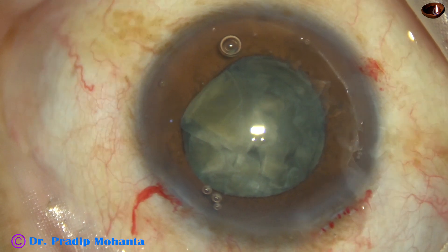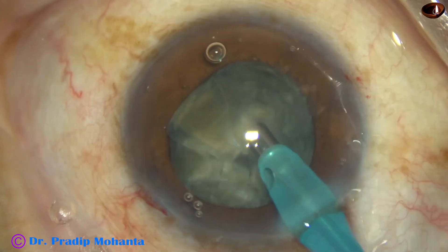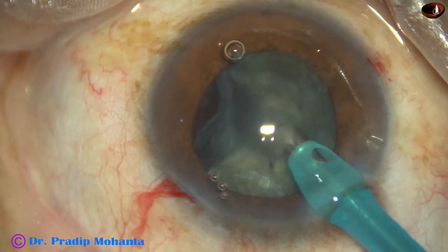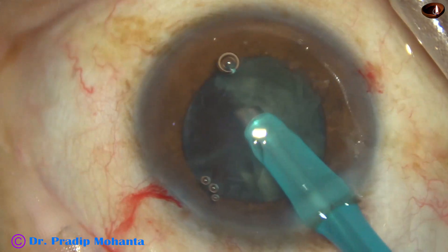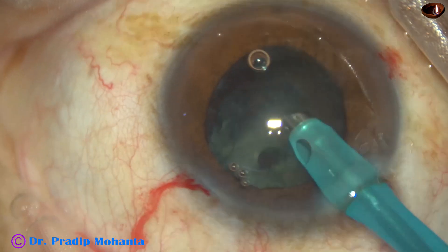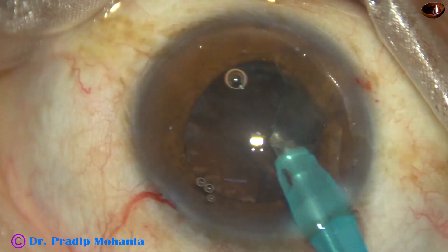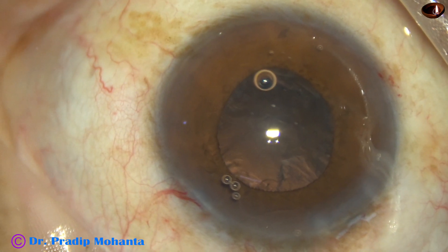Now, as I inject viscoelastic, the pupil dilates. And as I emulsify the pieces single-handedly, you'll see that the pupillary dilatation will remain almost the same size. The pupil is remaining dilated. I'm picking off the fragments one by one, facing the nuclear masses, and picking off the fragment from seven o'clock. The other fragment comes to the aspirating port of the phaco needle, and it is done. Single-handedly, the nucleus has been managed beautifully.